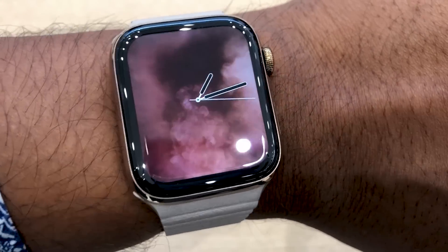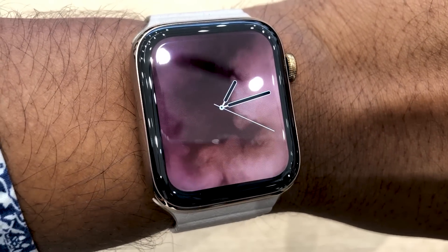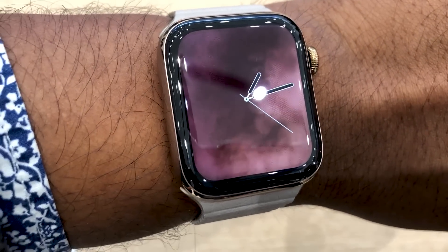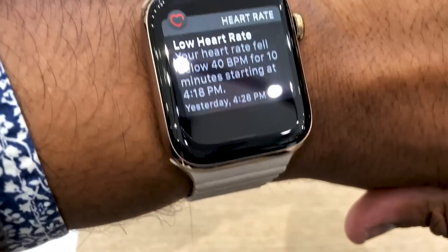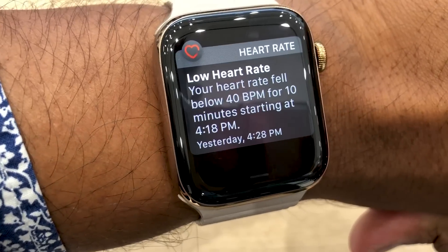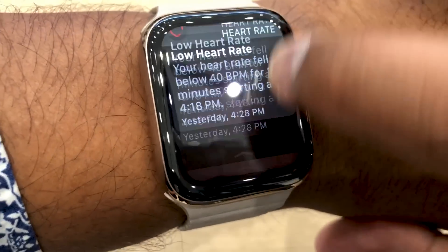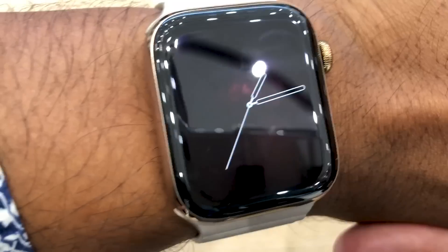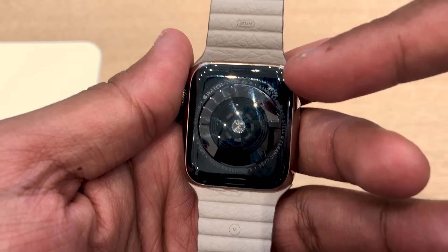The Apple Watch Series 4 can also detect when you fall, and it would send an alert to your emergency contacts if it doesn't detect movement after a minute. It can also tell you if it detects a low heart rate or an irregular heart rate for atrial fibrillation. There's a new ECG app available through the digital crown — just tap it to get an electrocardiogram and you can save it as a PDF to share with your doctor. The ECG feature won't be coming until fall, so we couldn't test it yet.